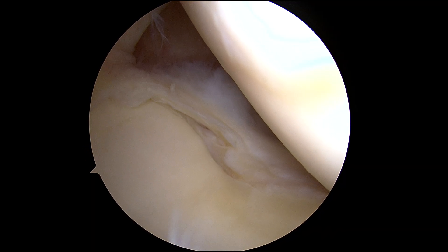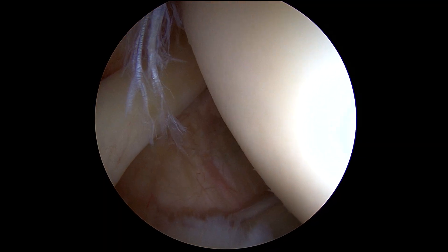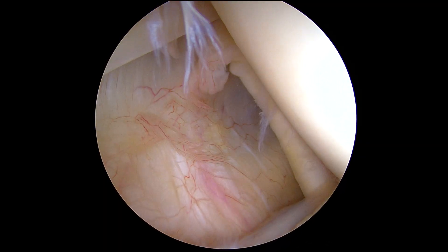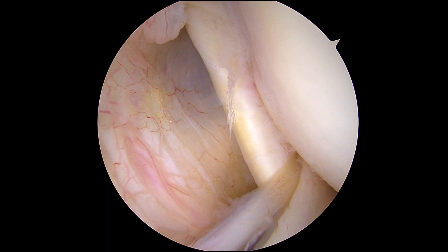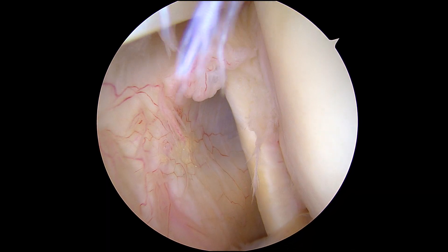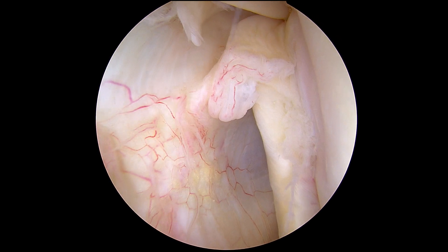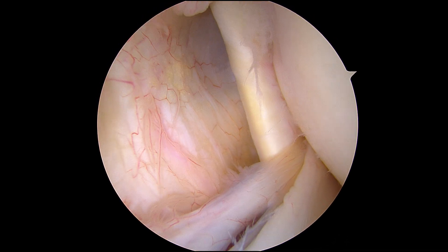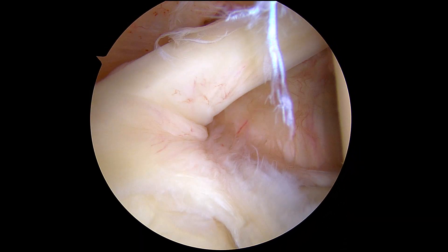If we move anteriorly into this little triangle here, you can see the subscapularis tendon, which is the rotator cuff tendon in the front of the shoulder. That looks okay to me — there's a little bit of fraying superiorly of the subscap, but overall that looks okay.